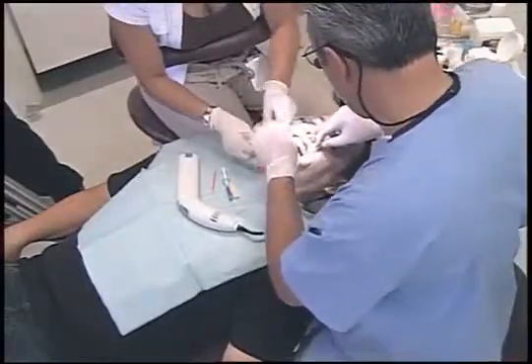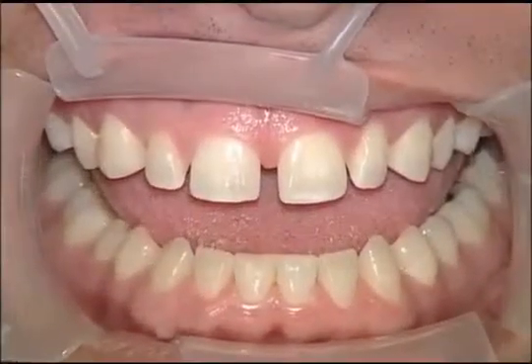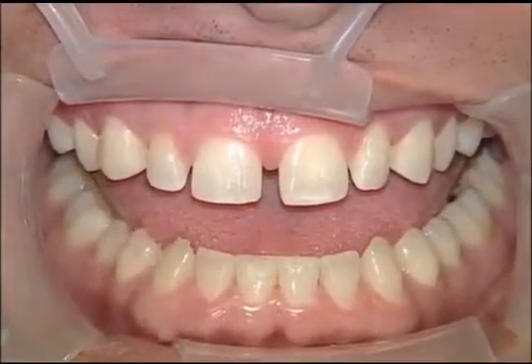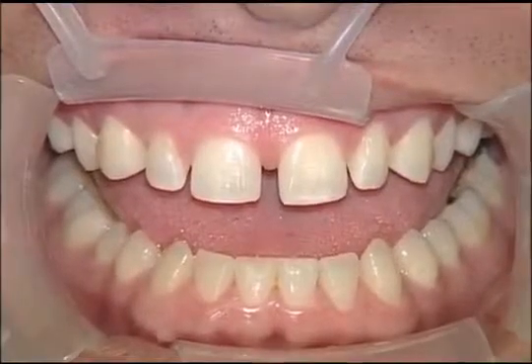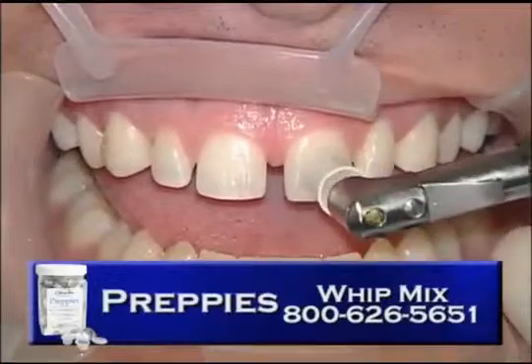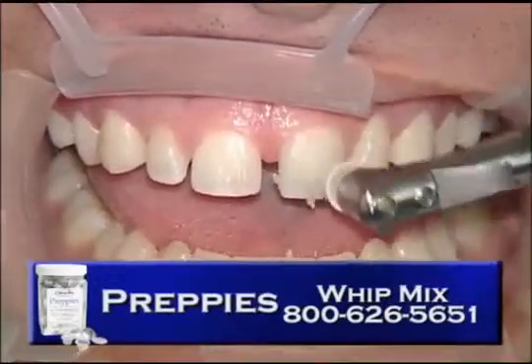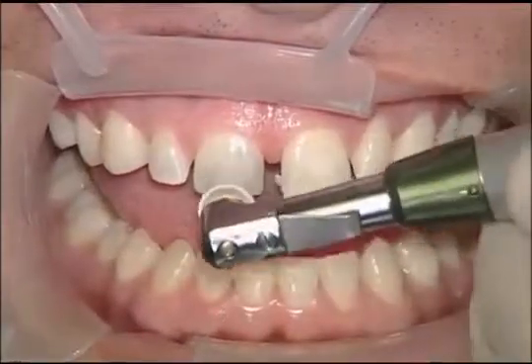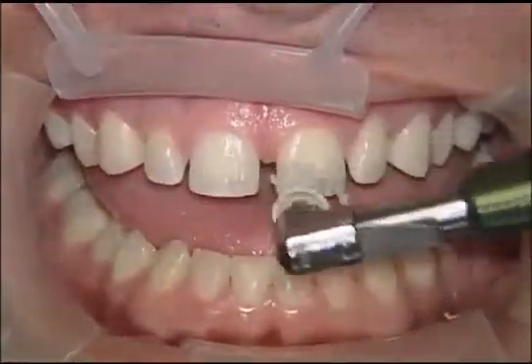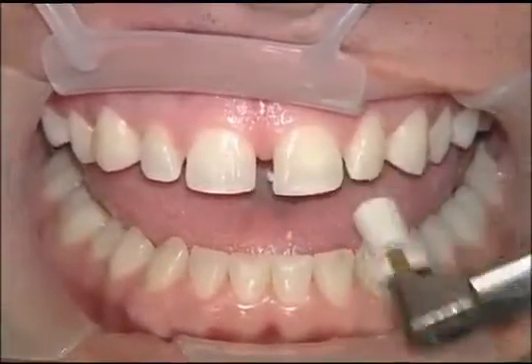And we already tried the veneers in, and Chris was happy with how they look. So we're going to go ahead and begin the bonding procedure at this part, and you'll get a chance to see them once they're in place. We're using some pumice here. I like to use Preppies from Whip Mix and a slow speed handpiece with a Prophy cup. And we're doing this to clean the tooth and remove any pellicle that might be on the tooth, and just make sure that we have a nice bonding surface here as we get ready to etch the enamel.